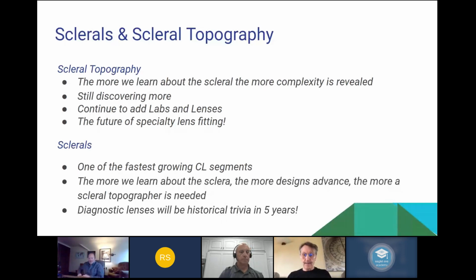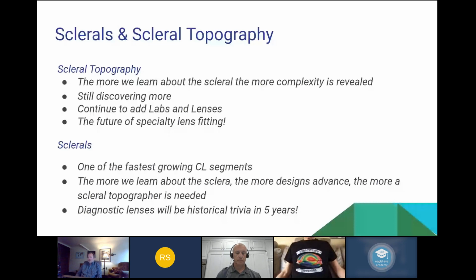So 5 years ago, the eye surface profiler came on the scene, and we're very happy to have contributed from the very get-go with the first device that measures not just the cornea but also the sclera, to a lot of discovering work. So what is that actual shape of the sclera? One of the main things that's come out very loudly is that the sclera is highly asymmetric. It's quite complex, and it is impossible to predict the shape of the sclera by extrapolation from the cornea out.